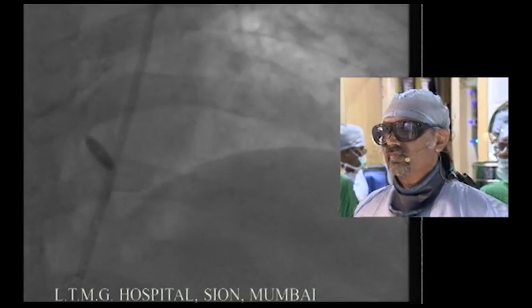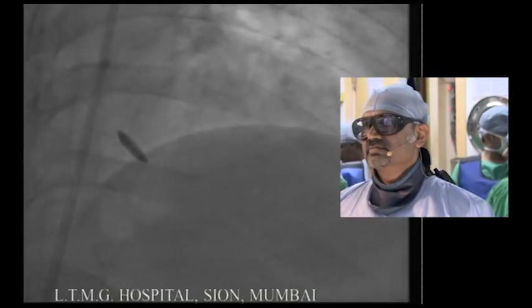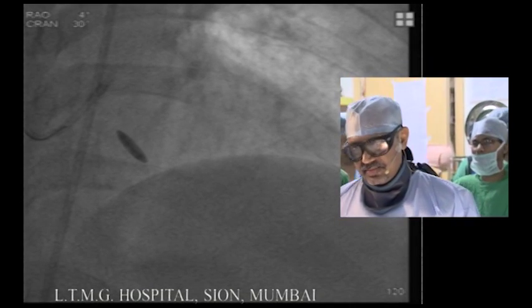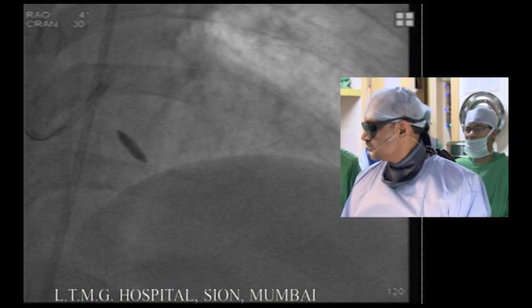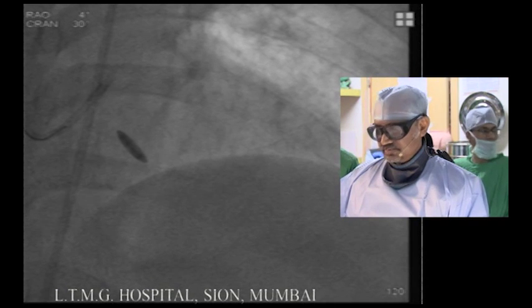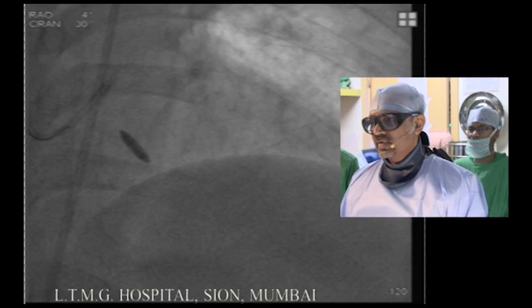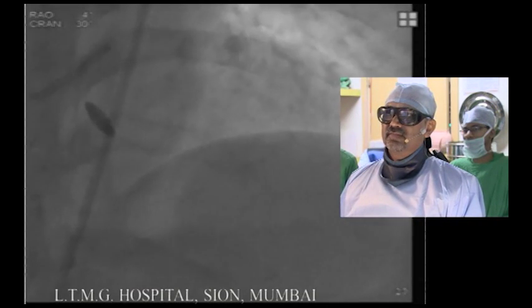Good morning, everybody. I'm Deepak Kapoor. Could I see the LAD film again? Show the film cranial. Yeah, whatever you had in the beginning. Show the film again.